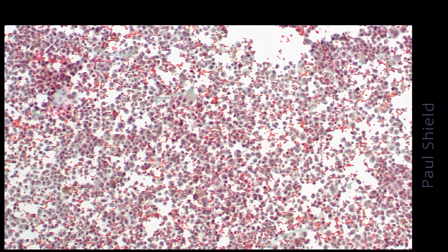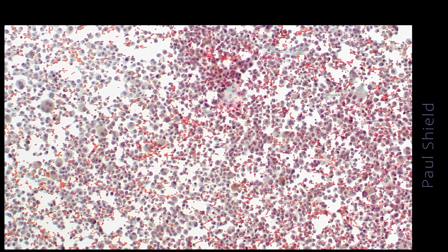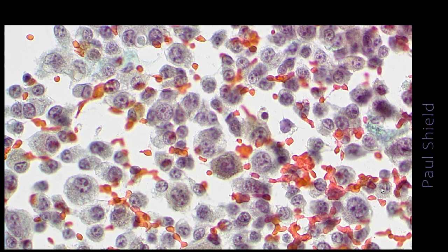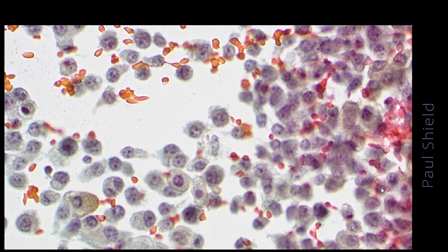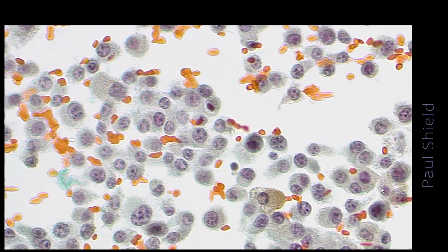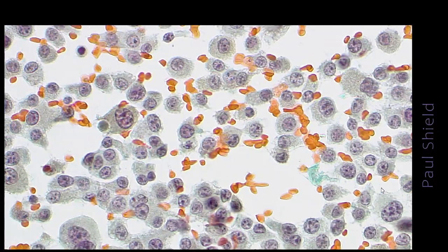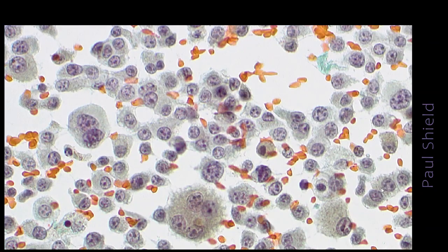This is the PAP, and it is highly cellular, mostly really dispersed. High power, again I can see the pigment, and here it's got that golden brown appearance to it, what you would expect on a PAP stain. And notice the nuclei, so I'm noticing that these are not hypochromatic like reactive mesothelial cells, but are in fact quite coarse and irregularly distributed.